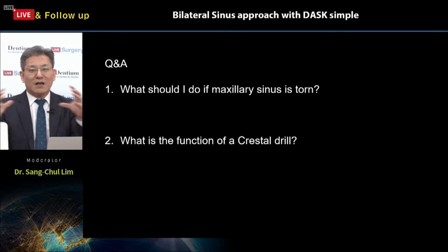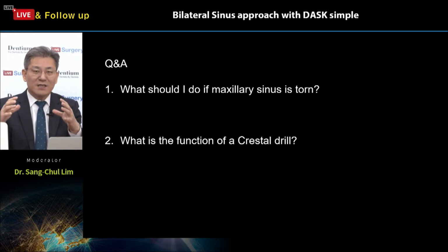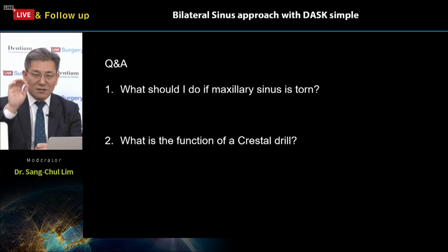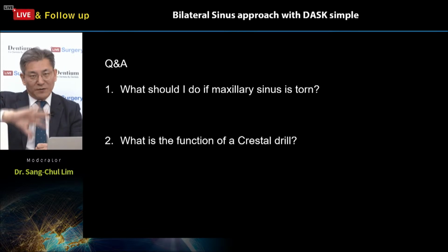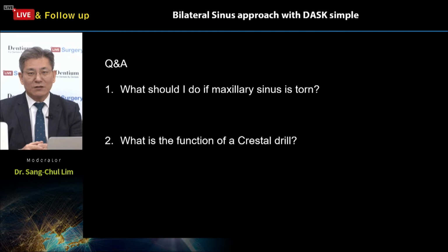However, when you have a lateral approach, we can also make a sinus membrane tearing. Depending on the size, if the tearing portion is big, it is very difficult to overcome with a procedure. Just stay there, cover with the flap, suture, and wait 4 months. After that, try again to make a lateral window according to the lateral window procedure, right?